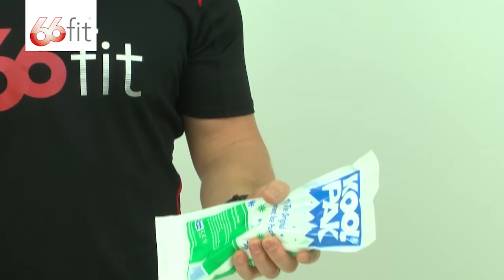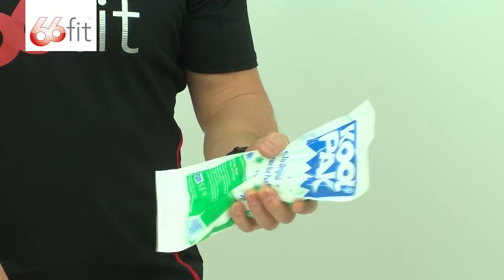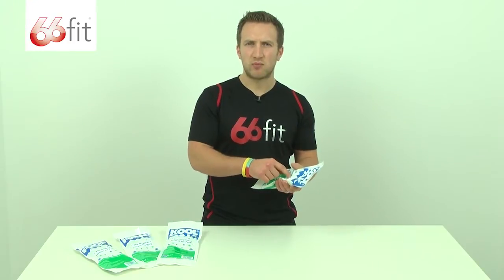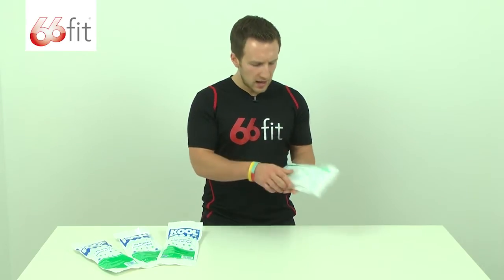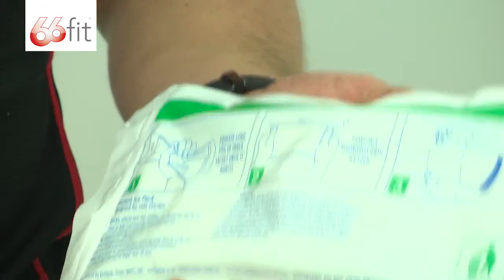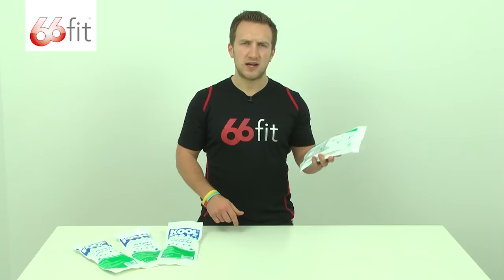Really easy to use. All you need to do is squeeze along the length of the pack until the inner sachet breaks, then shake it vigorously and it will instantly cool down. On the back there are some instructions to follow if you wish to read any more information.